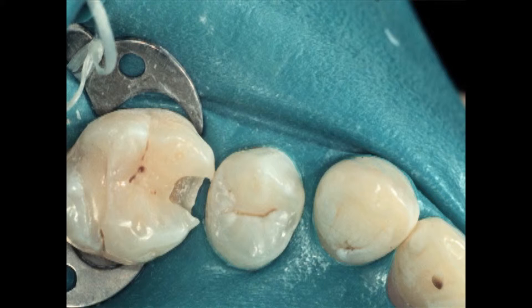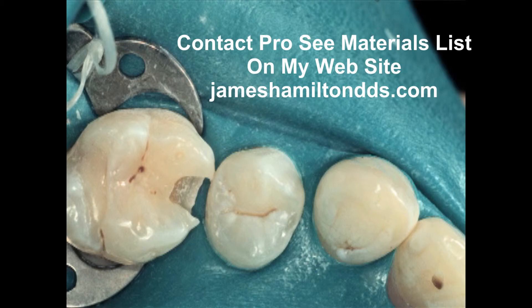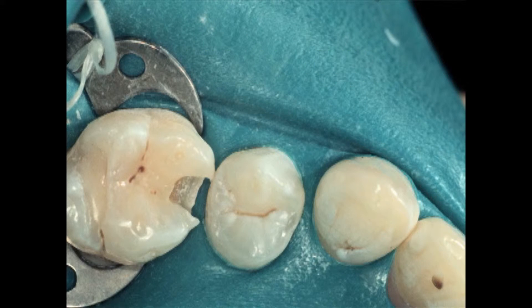We cut a slot prep — this was not caries, it was badly stained. We now fill that up. For posterior composites I use a minimum of two increments. My first increment builds the contact using a contact pro. For my second increment, the biggest difficulty in this technique is that you're going to put in more composite than you need — that's how we were taught. Instead, put in just a slight excess so that when you place the custom matrix, you have very little flash.